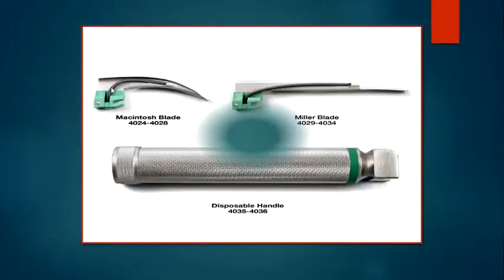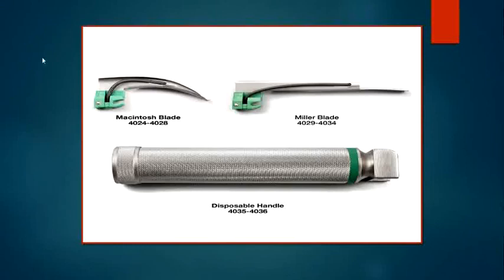Now, we have two types of blades. We have the curved one, called the Macintosh, and the Miller blade, which is the straight one. This is, as we said, the disposable handle that contains the battery for using the laryngoscope.